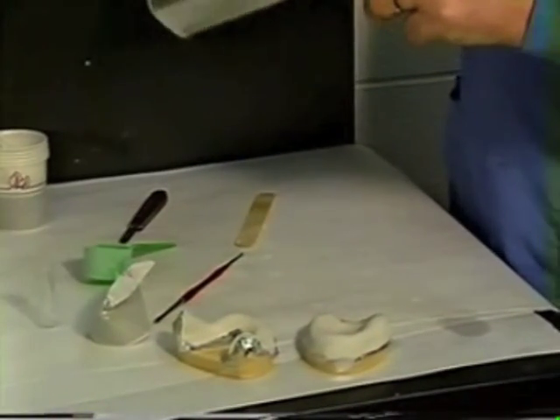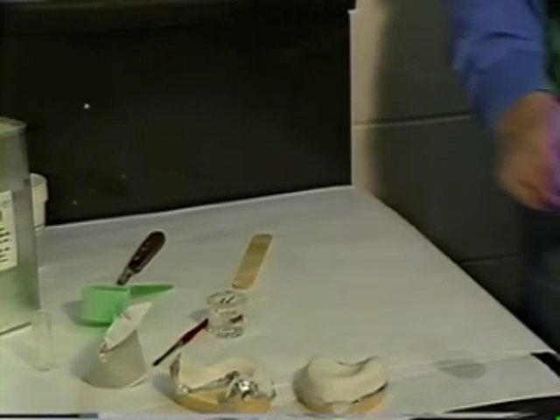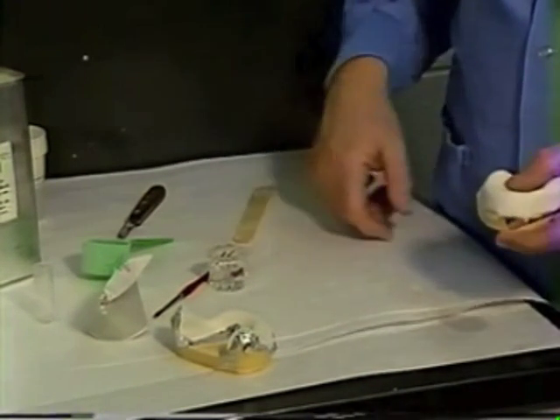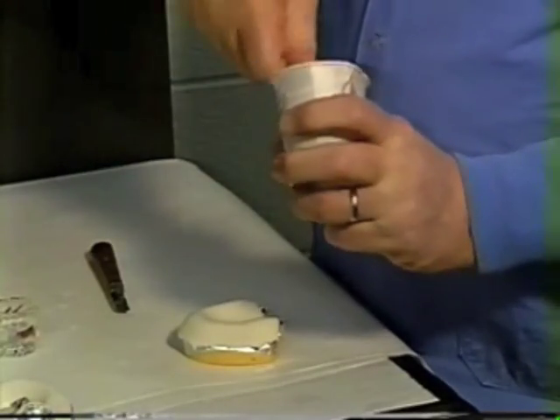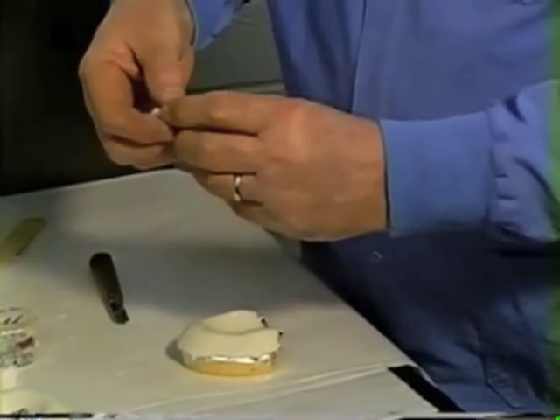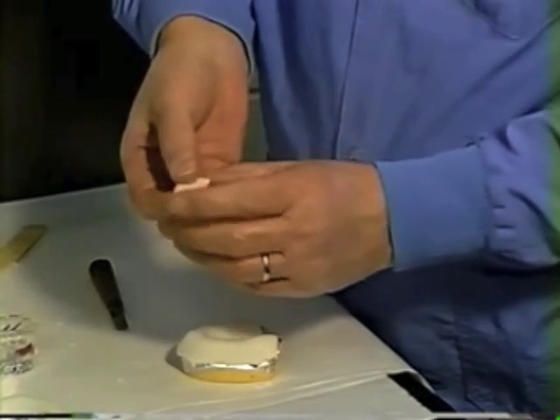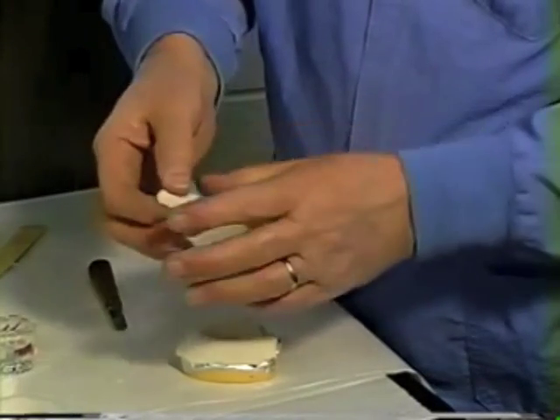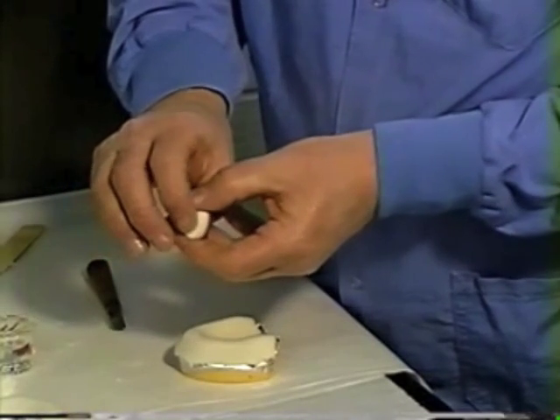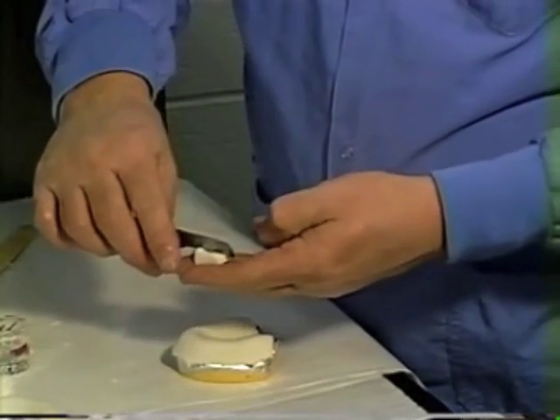Put a little monomer into a dapping dish and have a brush handy so you can attach the handles to the tray with just a little monomer controlled with a brush. Take a plug of material and work it with your fingers into a nice square arrangement — about a half to three quarters of an inch wide and a half inch long. Cut off any excess so it's not too long.